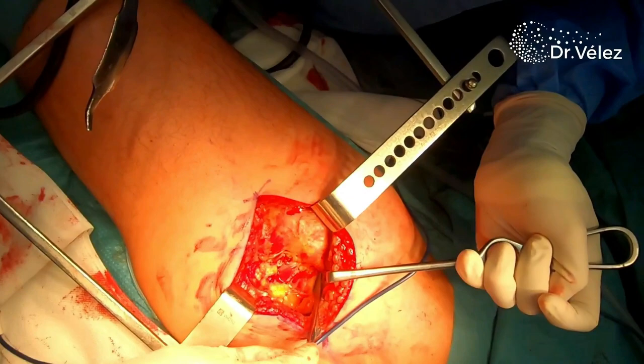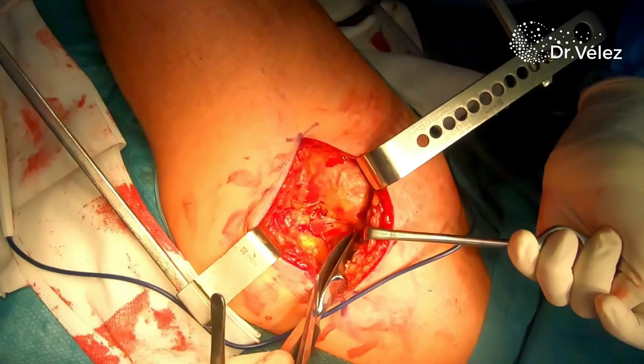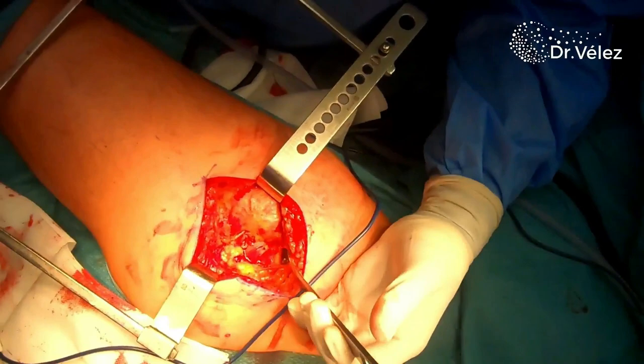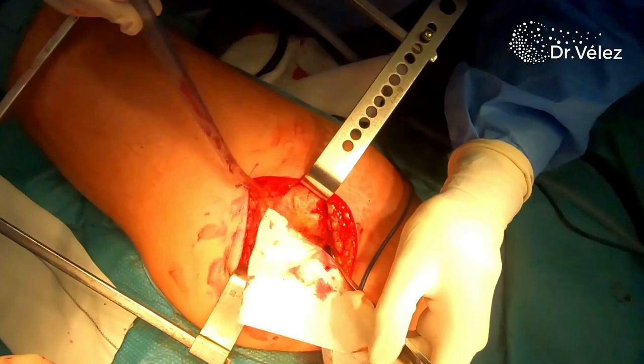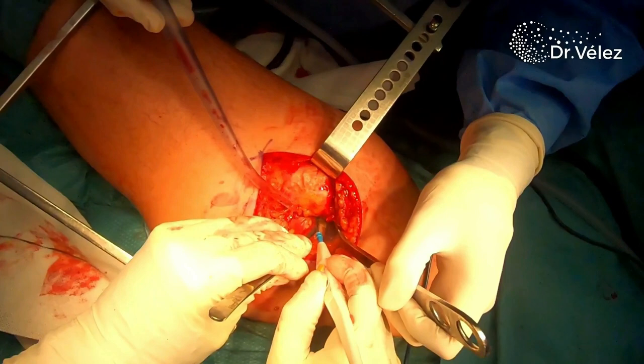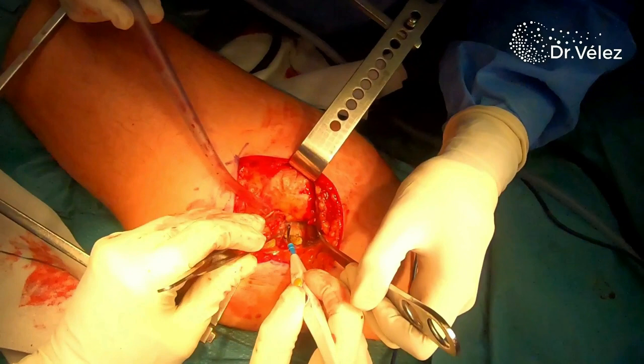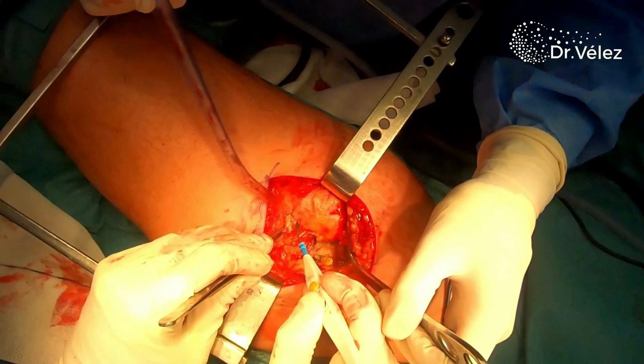Then with a periosteal elevator, we find the plane below the gluteus minimus, inserting a Hohmann retractor and exposing fully the external rotators. We then release the external rotators, staying close to the posterior aspect of the greater trochanter and the femoral neck, from proximally to distally, exposing the hip capsule, which is also incised in the same plane or line.